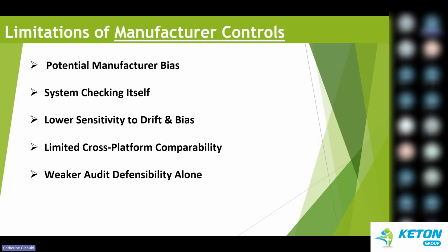In other words, they have been enhanced to act nicely with its own reagents and its own analyzers. So it is biased; it has been optimized only to work with that, and usually it will not catch any other drift or shift. It is only monitoring that reagent and that analyzer.